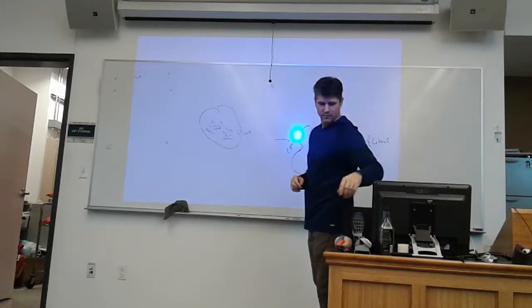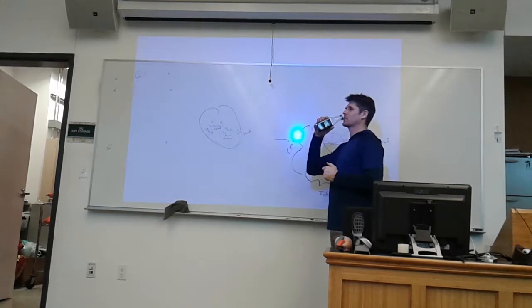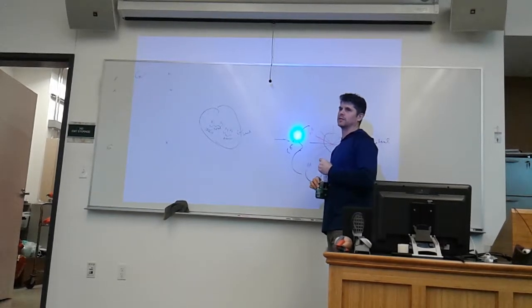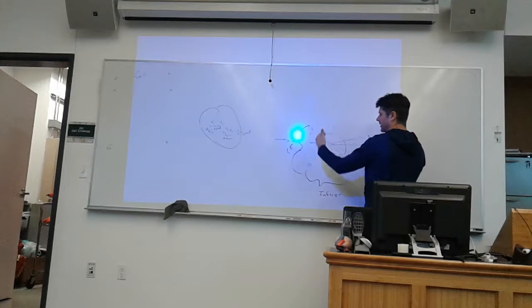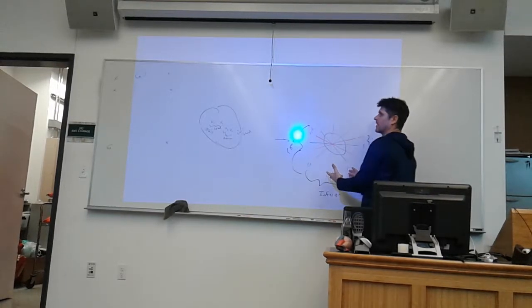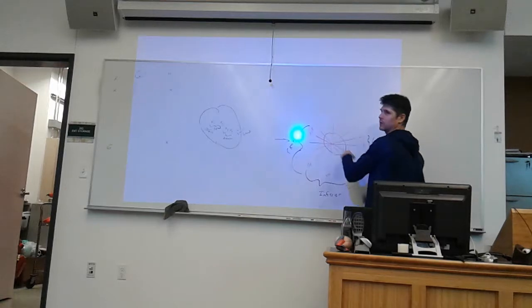How do they place the negative spot in the center of the heart? It's an algorithm that the machine does. It takes what these leads are coming up with in all of the measurements, and the placement of all of these leads together, and then it creates an algorithm that estimates what the middle of the heart is.